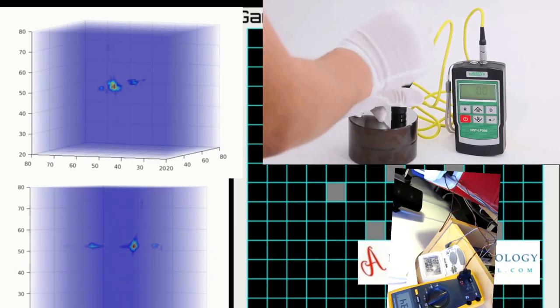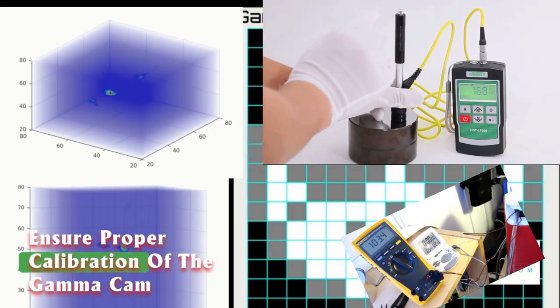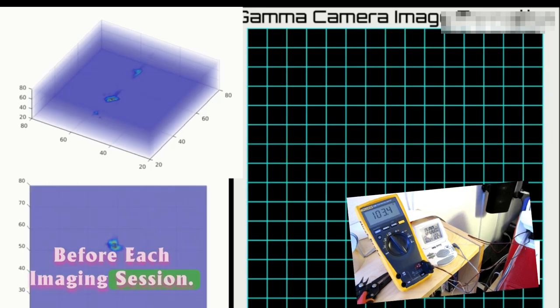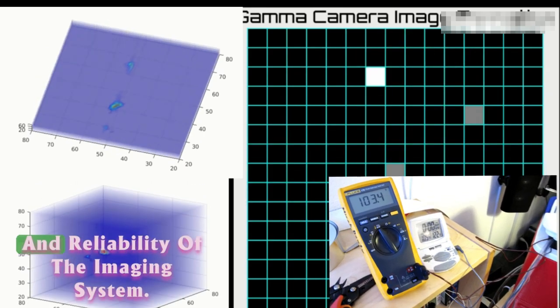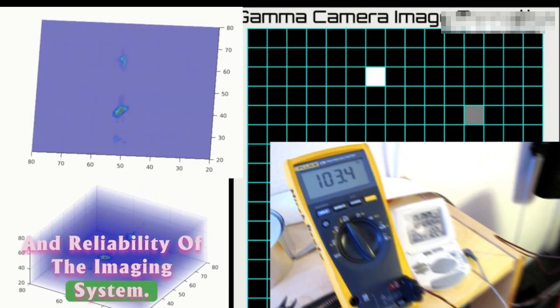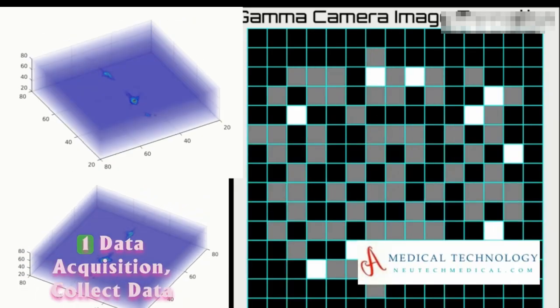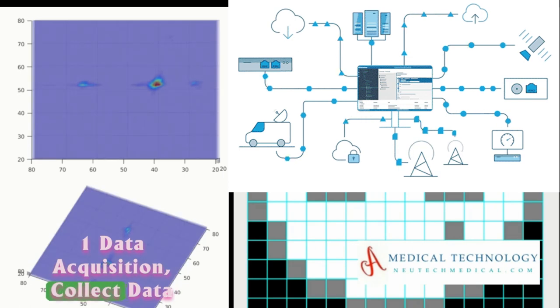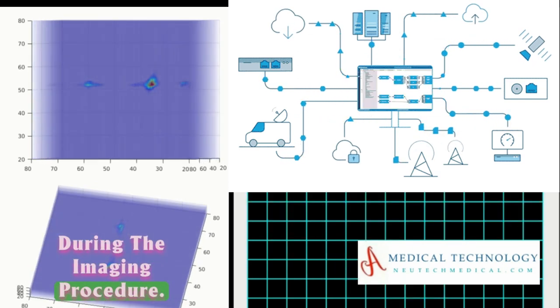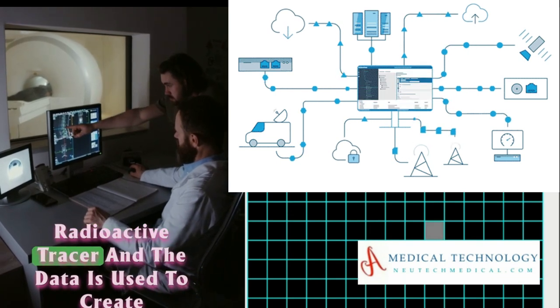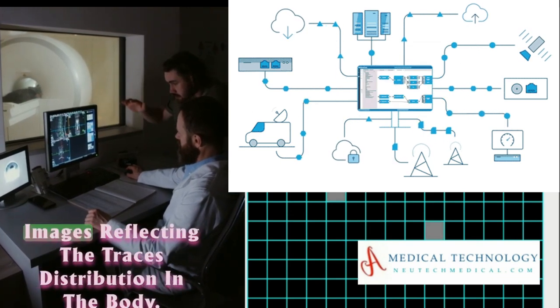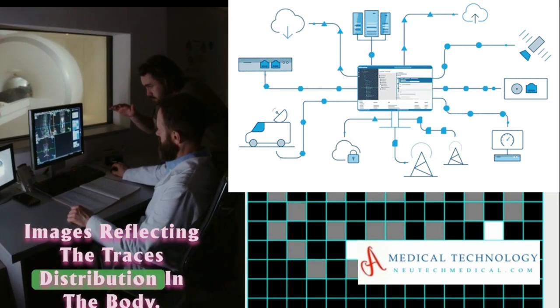Instrument calibration: Ensure proper calibration of the gamma camera before each imaging session. Regular calibration checks help maintain the accuracy and reliability of the imaging system. Data acquisition: Collect data during the imaging procedure. The gamma camera detects gamma rays emitted by the radioactive tracer, and the data is used to create images reflecting the tracer's distribution in the body.